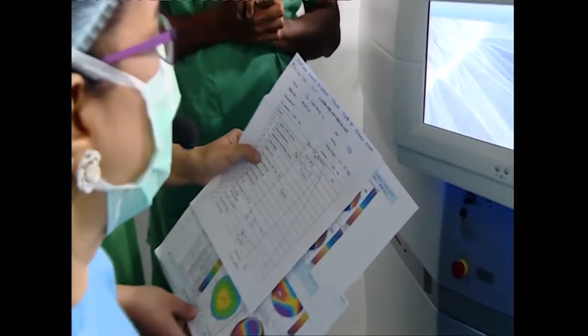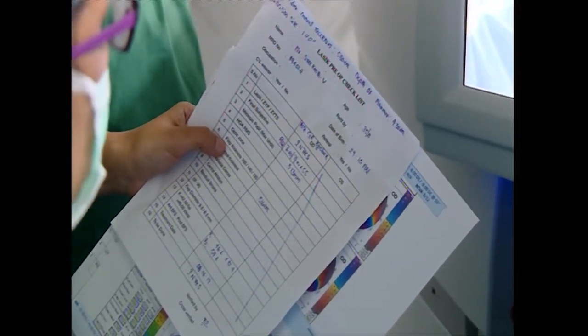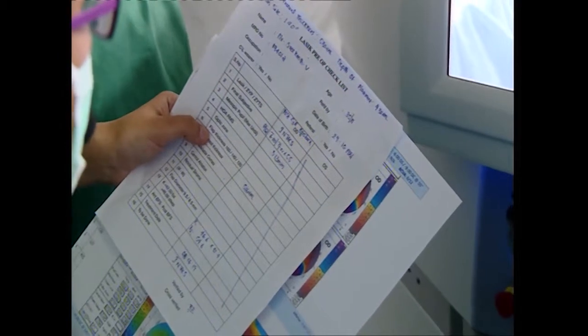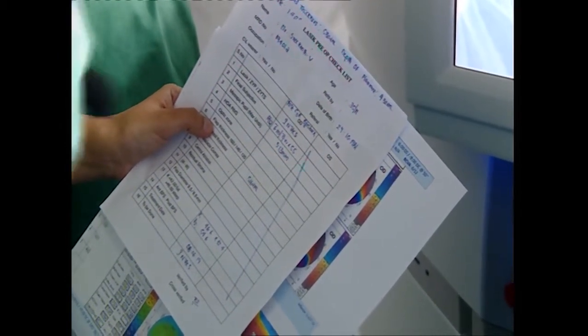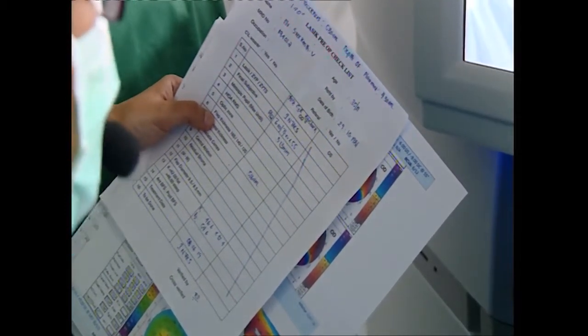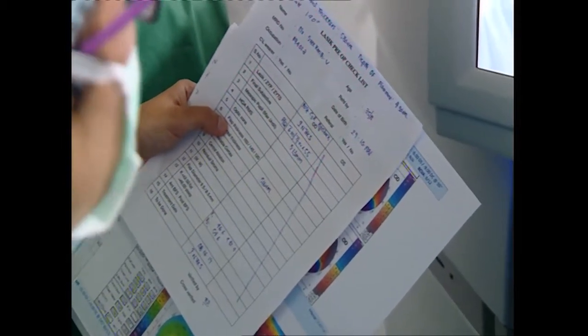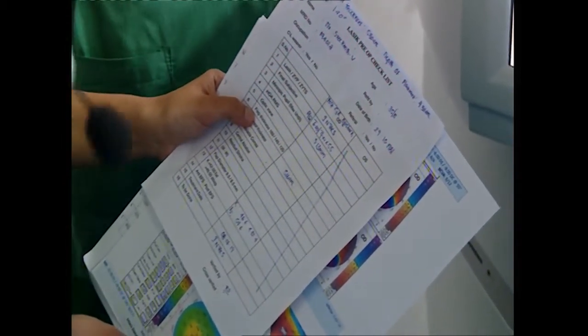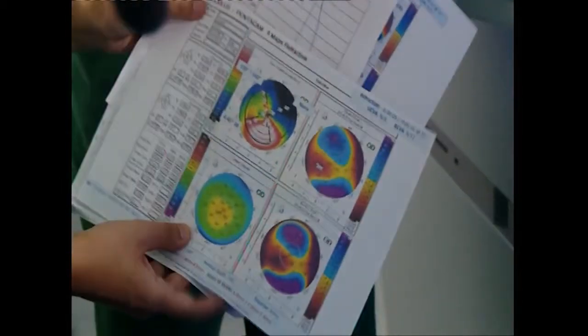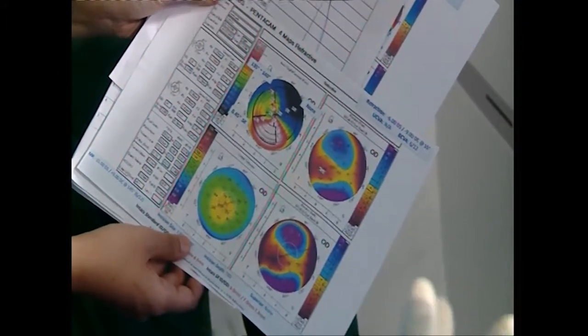This patient is a 35-year-old who has a unilateral advanced keratoconus, and his manifest refraction is -6 with -9 at 55 degrees. And he gets a BCVA of 6/12 with this correction. Uncorrected vision, of course, is less than 2 meters. Can you go on to the next slide, which shows the topography? It is obvious to all of you there in the audience that he has a very advanced cone.